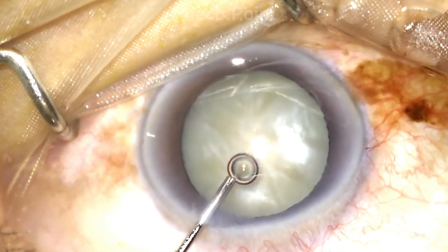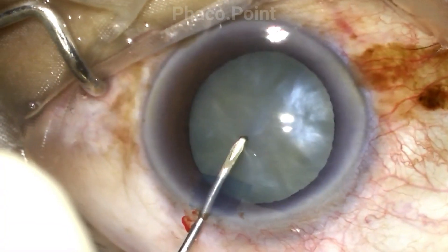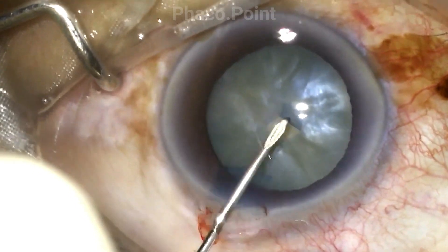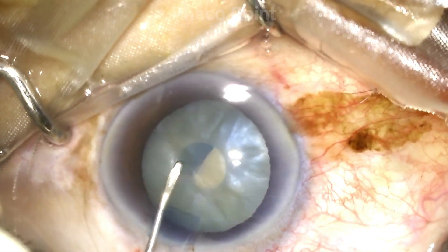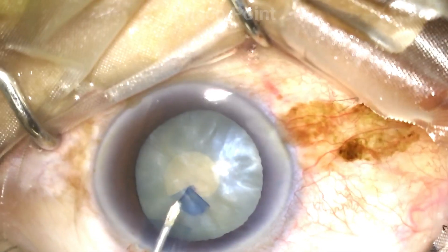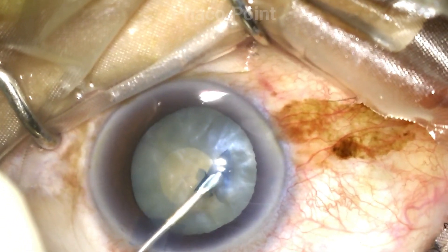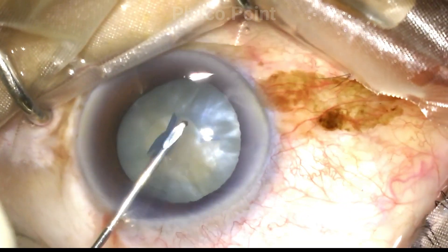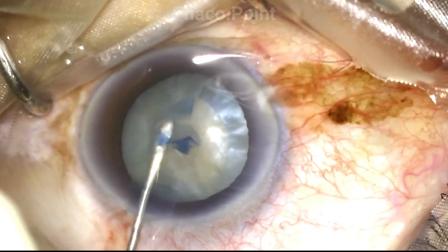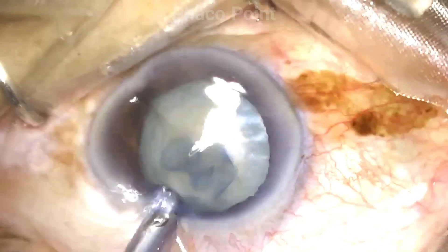We start with the incisions, followed by the staining of the anterior capsule adequately with blue dye and performing the capsulorexis. Please note that there is always a tendency of these rexes to run away into the periphery, and therefore we as surgeons tend to make them slightly smaller to give us that little added control. Here you can see I'm performing a spiral rexis, and with care and caution I'm able to complete the capsulorexis satisfactorily. The resultant rexis is fairly circular, well-centered, and about 4.5 mm in size.